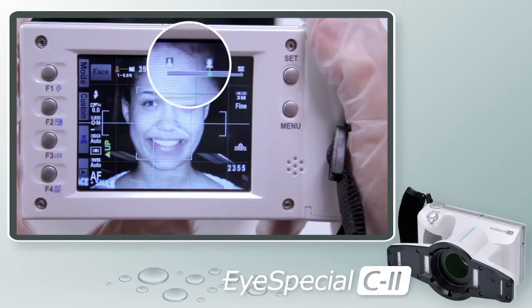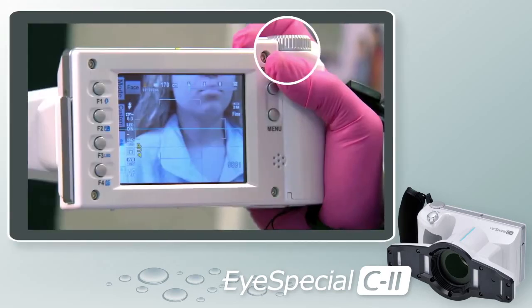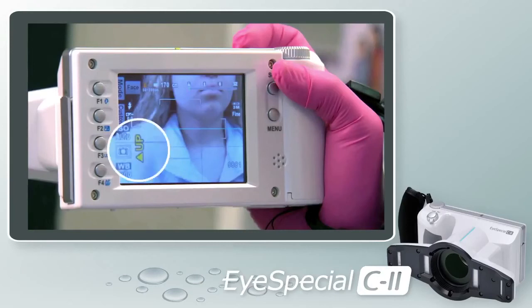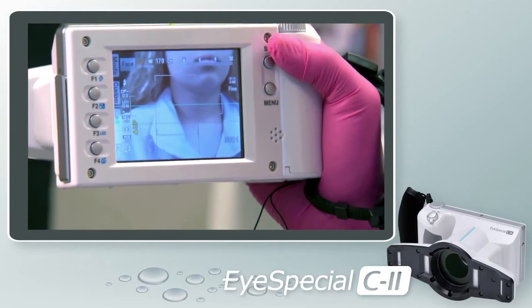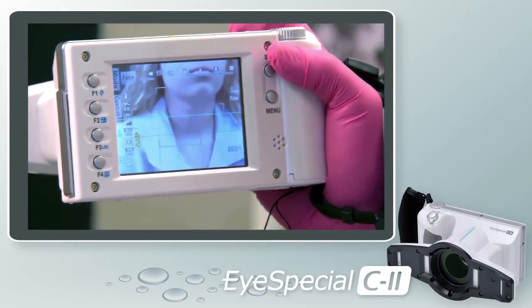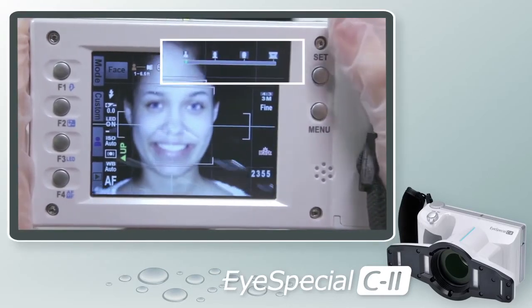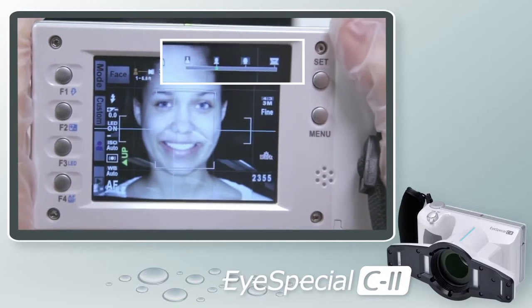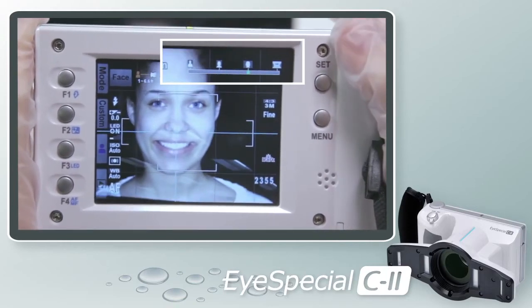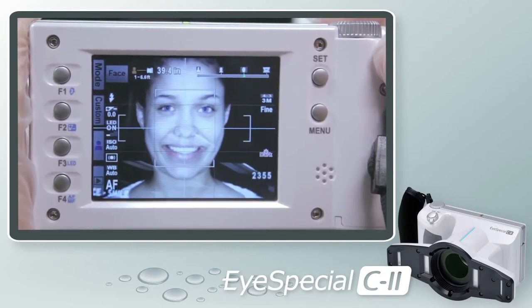The first two icons show the shoulders in the frame; the second two do not. When you rotate the thumb dial all the way to the left to select the first icon, notice in the lower left corner the word 'Up' in yellow — a reminder that when taking a shot with the head, neck, and shoulders in the frame, you must turn the camera vertically. When you rotate the thumb dial to the third and fourth icon, the word 'Up' disappears. You can then move closer to the subject, return the camera to a horizontal position, and take your shot.